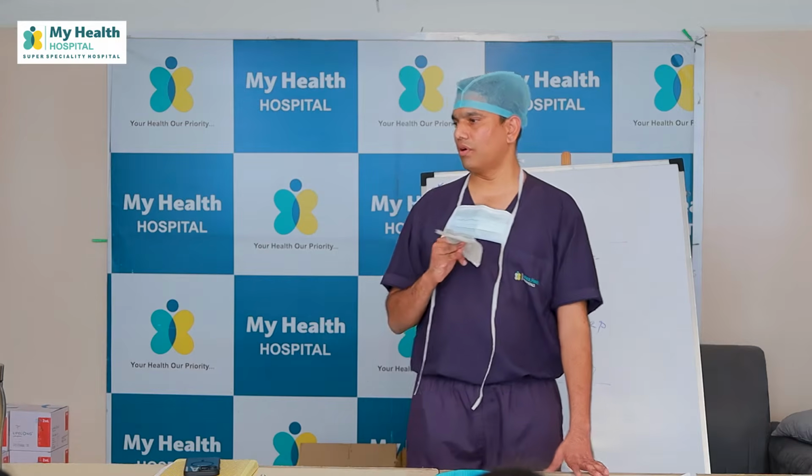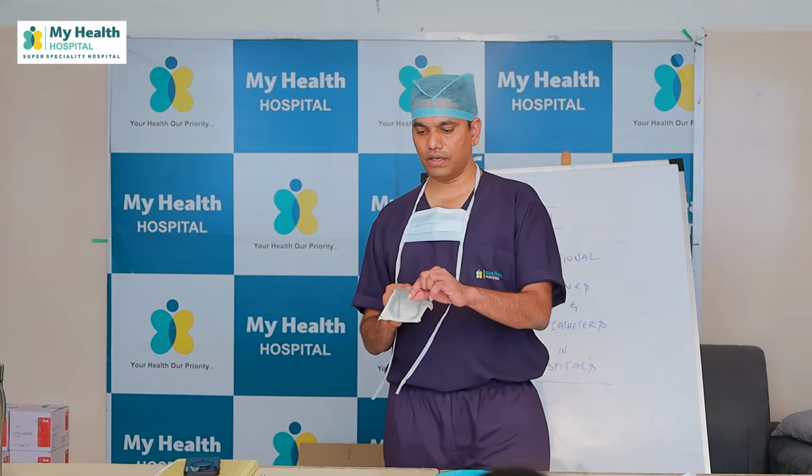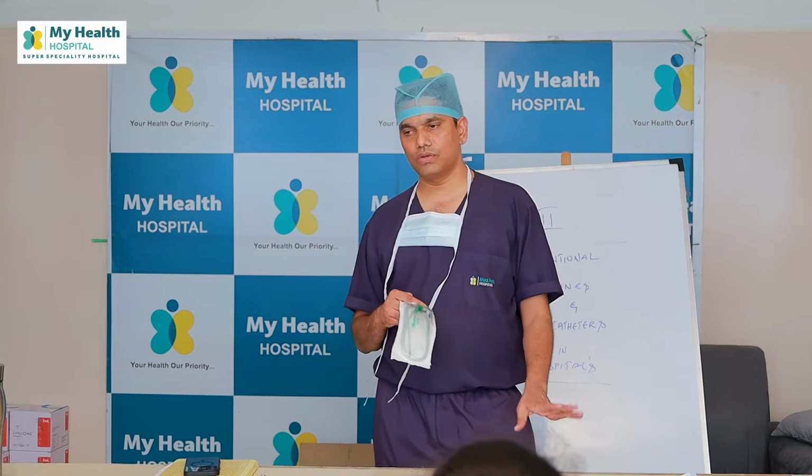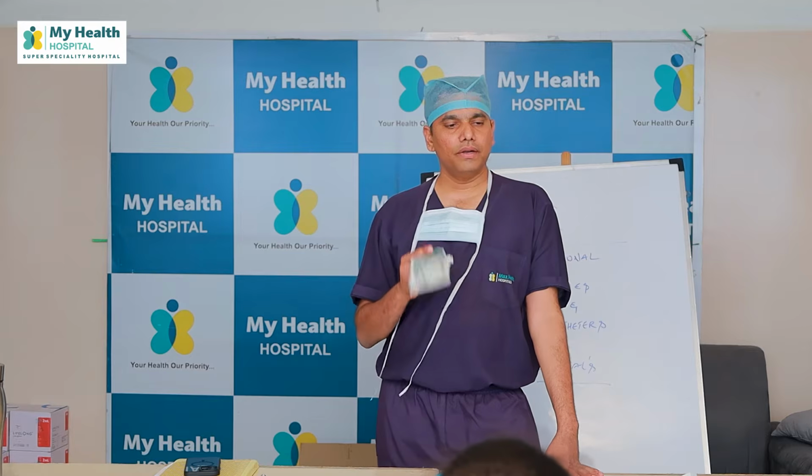14 is not preferred. 16. 14 is too small. If you give something, the pores will get clogged, and day 3, day 4, you can't feed him. So you have to push. There will be a lot of resistance. So 16 is ideal. And for surgical patients, for stomach decompression, you can use 14.